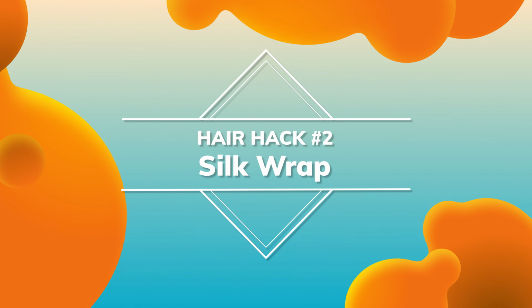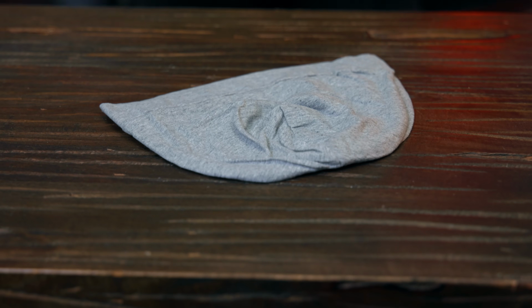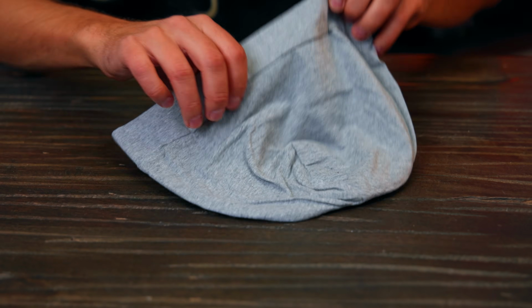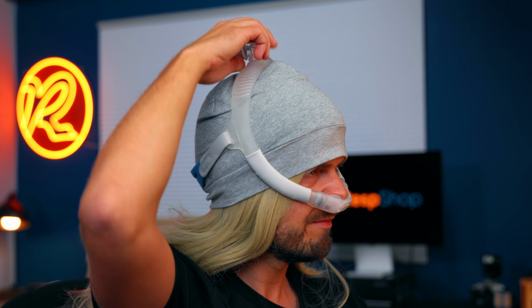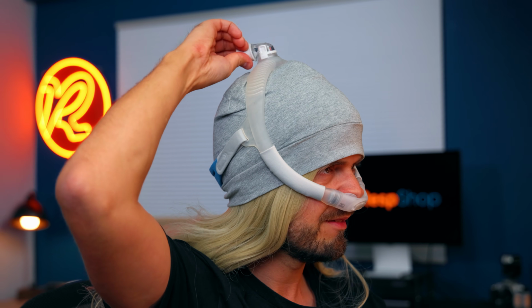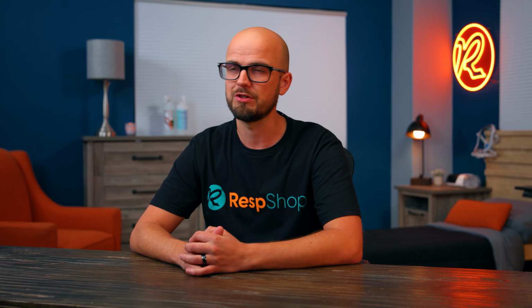These things can be hair traps. Ouch! Hack 2. If hair damage is a problem, or if the headgear is ruining your luscious curls, then some find that a silk or a satin wrap can work wonders. You can either get ones that you wear over your hair that the headgear then goes over, or you can get wraps designed to go over your CPAP straps themselves. In either case, the fabric prevents hair snagging and damage from the pressure points, keeping your hair damage-free and protecting its look as much as possible.